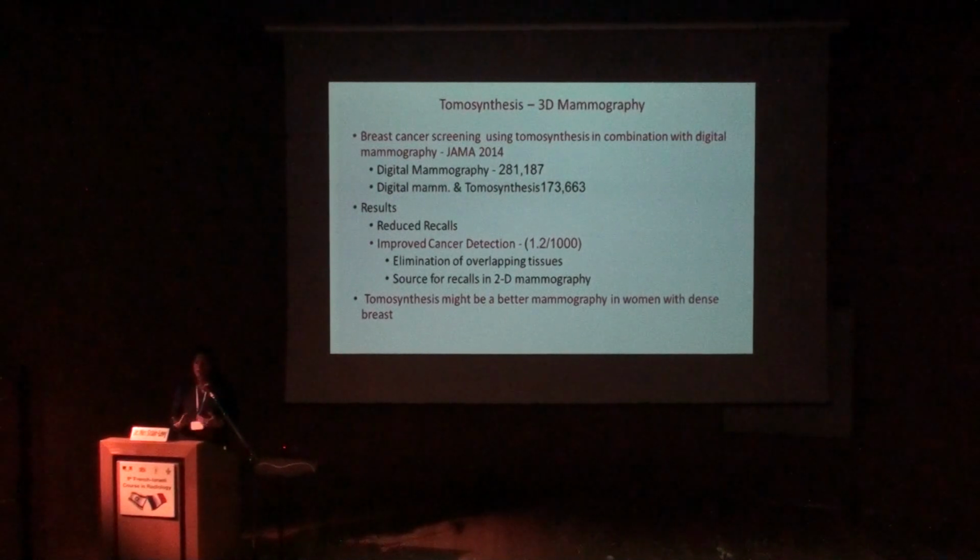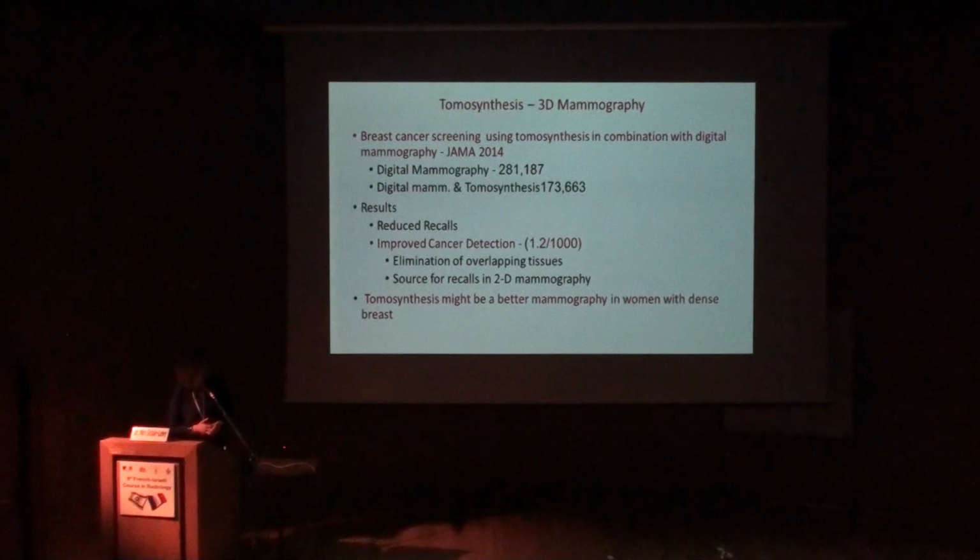Is it going to replace mammography for the screening? It seems that it is going to, but the disadvantages are more radiation and longer reading time. Instead of 4 images, we have to read 8 images. So there is a continuous debate, but there is more and more data that says that, no doubt, tomosynthesis is better imaging than mammography only.